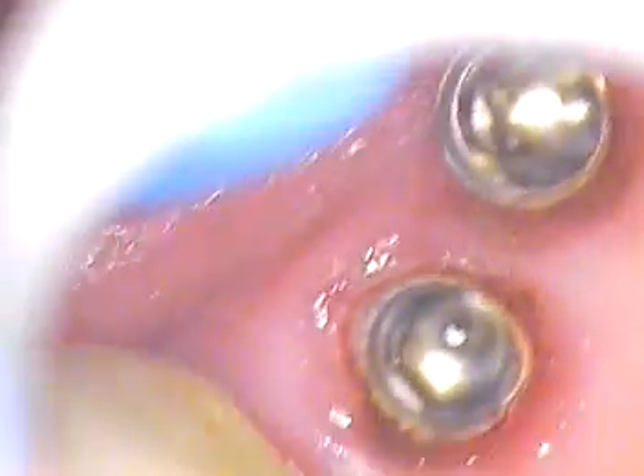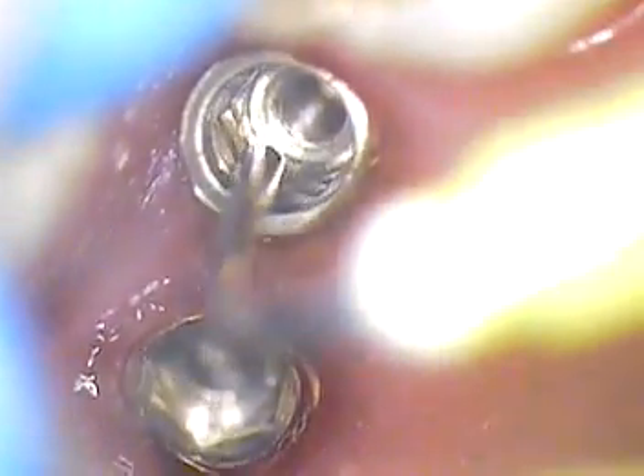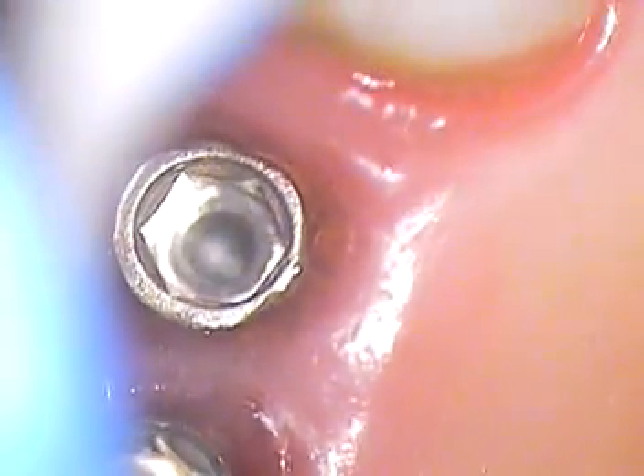We're going to go back in now with micro suction and do another visual. Starting to look more and more pristine. That's good. We'll do one more wash now — let's see if we get any color change. Looking great. What's working in our favor here is that they're not so subgingival.